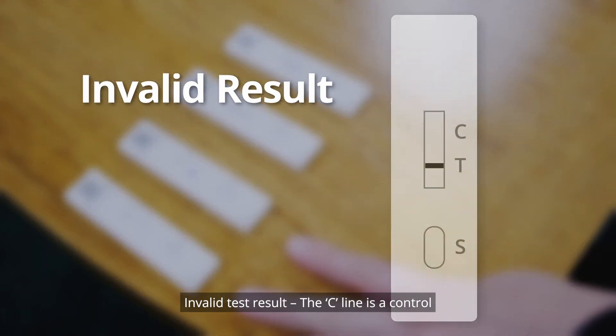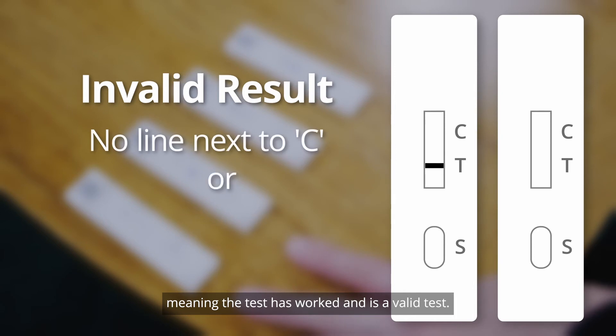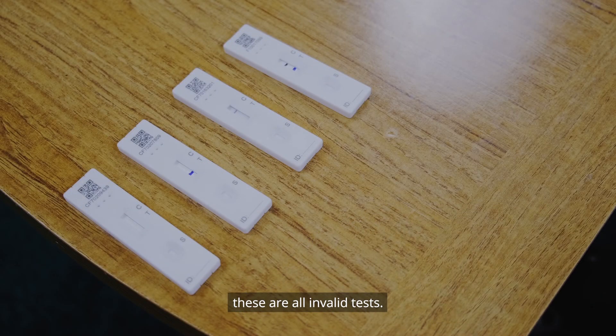Invalid test result: The C line is a control, meaning the test has worked and is a valid test. If the line is not there, it means the test has not worked properly and you will need to do the test again, starting from scratch. Other invalid tests may show no lines in any of the control indicators, or a single line in the T indicator. These are all invalid tests.